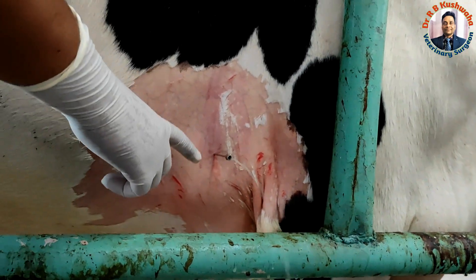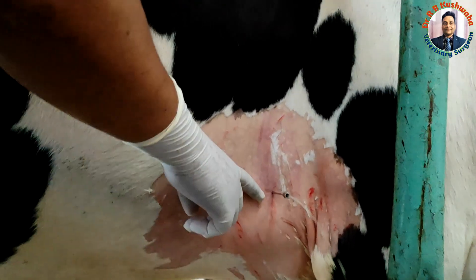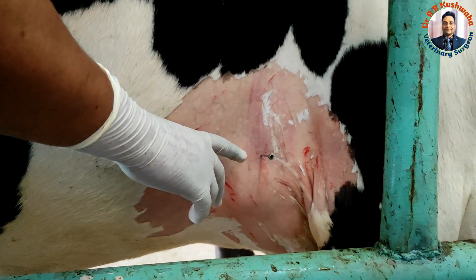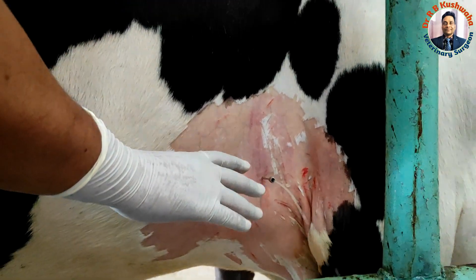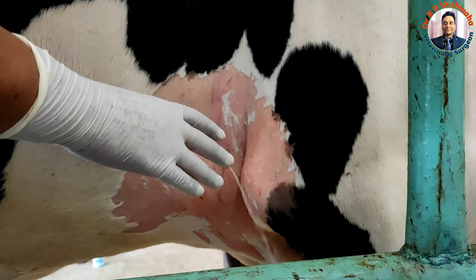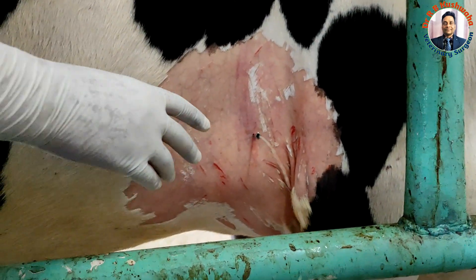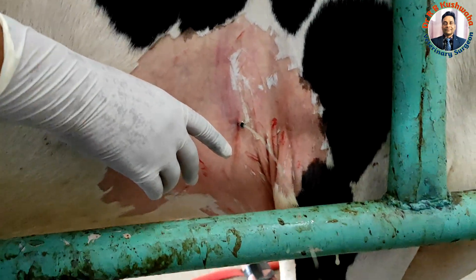If you do not give the sedation and local anesthesia, there will definitely be a lot of pain. Just to reduce the pain, you should at least give local anesthesia. If the animal is docile, it's okay, otherwise sometimes you have to give sedation. If you don't have butorphanol and ketamine, even xylazine alone will do. You could see here how the fluid is flowing.